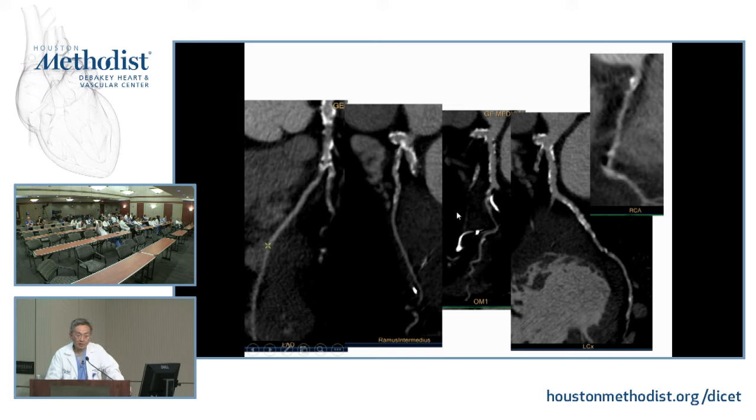It's not easy, especially if you don't have the best scanner with the best technology. Would a Porsche help navigate this rocky road? I'm sorry? Would a Porsche help navigate this rocky road? Meaning if you had the dual-energy scanner, would it be significantly less problematic? Could be.